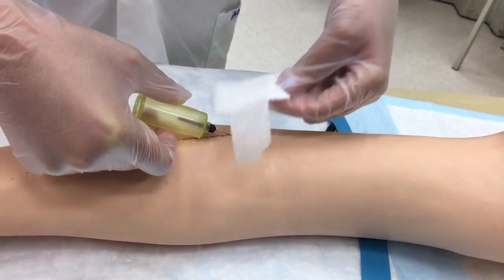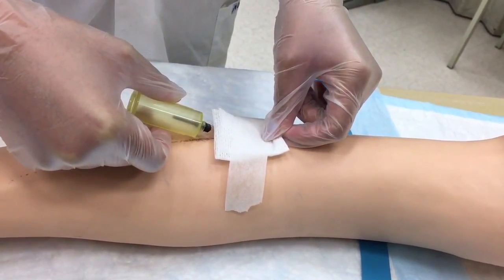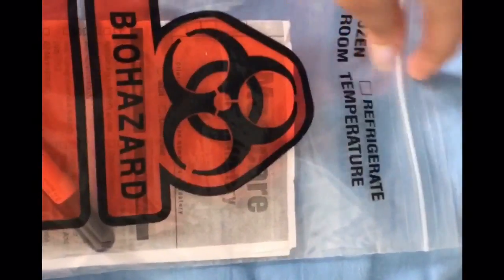Take your gauze and put it on, but do not apply pressure until the needle is removed. Remove your needle and then throw it in the biohazard container. Also, vials have different colors for different tests, so depending on what you're drawing blood for, make sure you select the right color vial, and then send it to the lab.